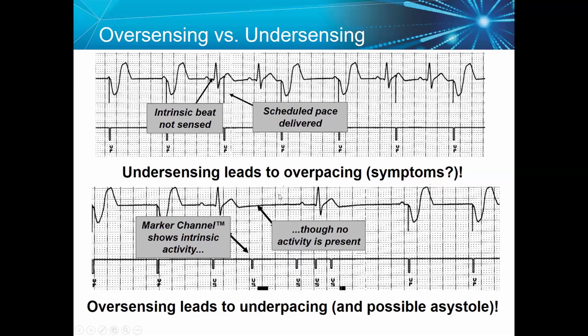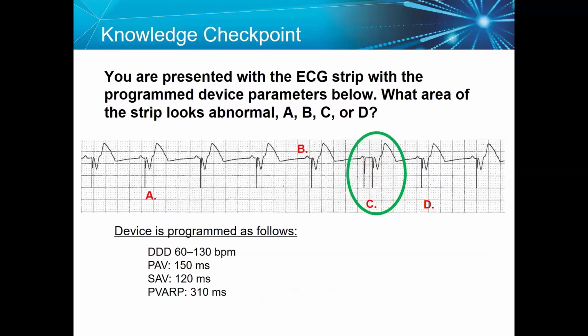So it is very dangerous. Undersensing may cause arrhythmia because the ventricular spike will pace on the T wave and doesn't see the intrinsic beat, and oversensing may cause inhibition of pacing. So we just need to be sure that sensitivity and sensing are appropriate.